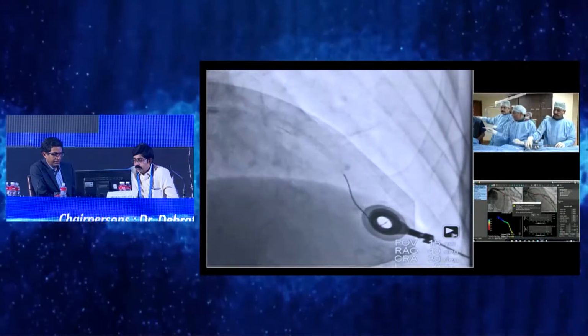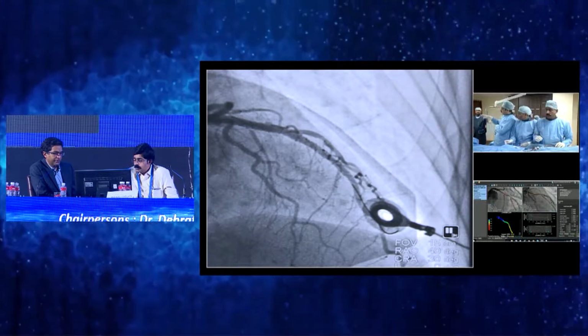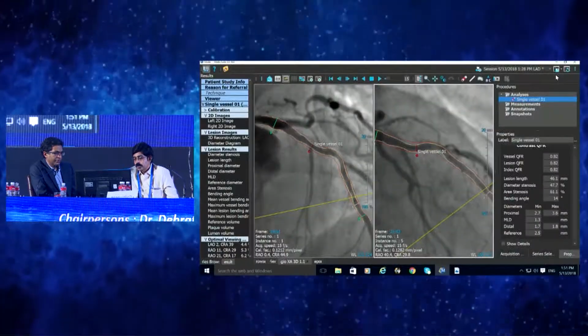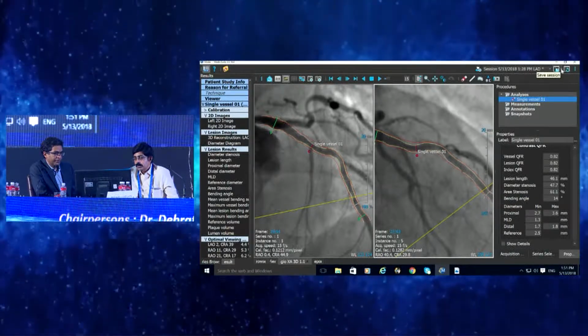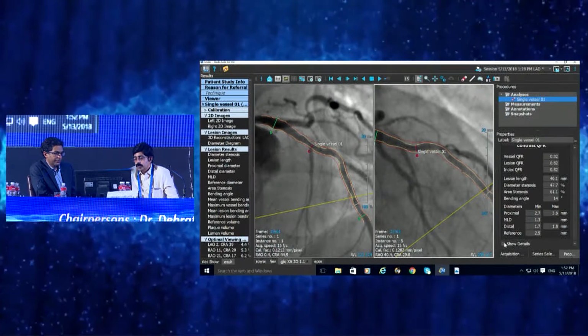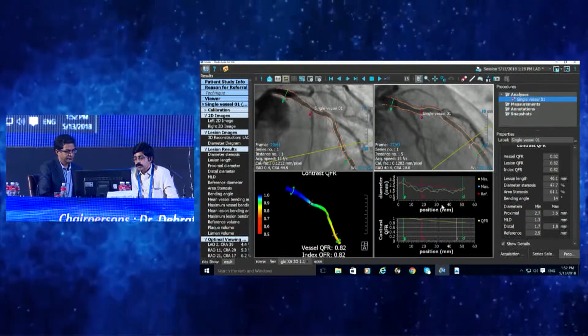Can you tell the technician to put the QFR on the big screen, please? Show the QFR picture as she is calculating. Yeah, this is good. Now you can run through the steps of what is happening. Meanwhile, we'll finish up this. Show this screen.